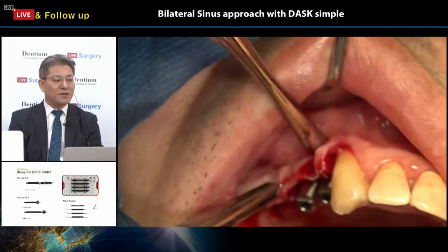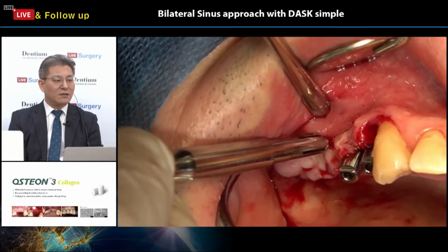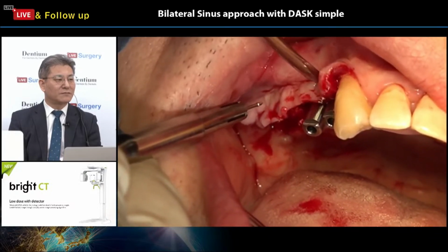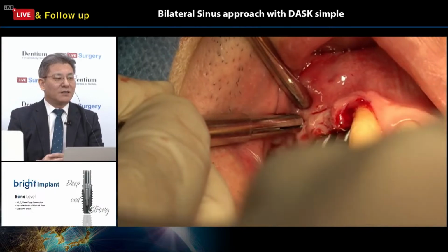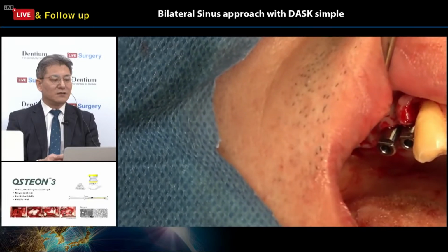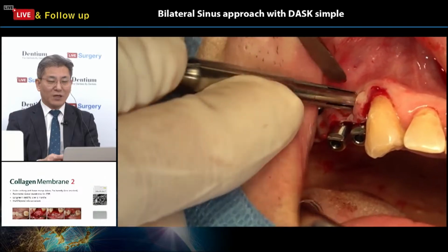And instead of flap suturing, he is going to use a pin for fixation of the flap. Okay, so this pin has a notch to easily engage the bone. Dr. Chung prefers to use this pin instead of suturing.